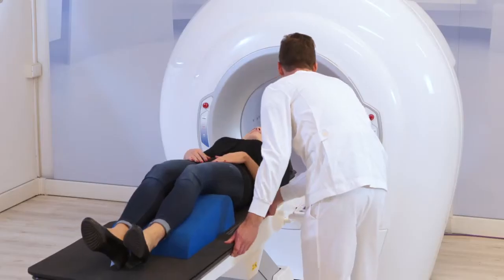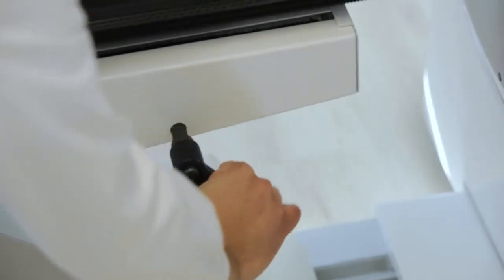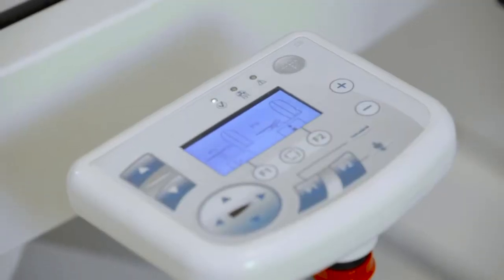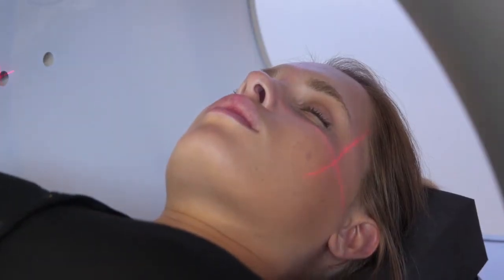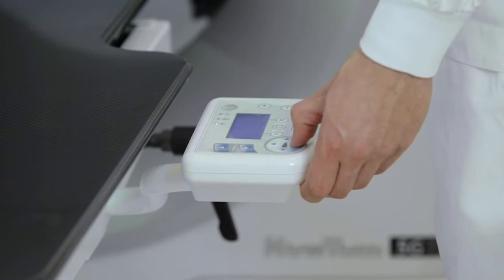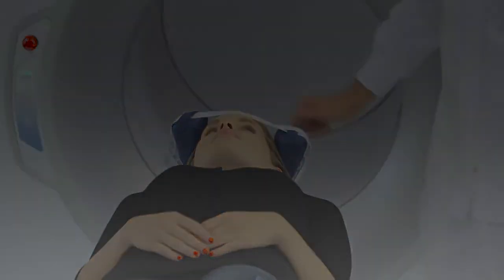Unlock the gurney and slide it to move the patient into the gantry, then lock it again. For precision adjustments, the laser centering device can be used. To activate it, press the laser key on the control console. In this case, it is necessary to have started the NNT software, or on keypads on the sides of the scanning unit. Perform a fine adjustment of the patient's position using the movement control keys, up, down, left, right. If necessary, fix the anatomical part with the supplied fixing devices.